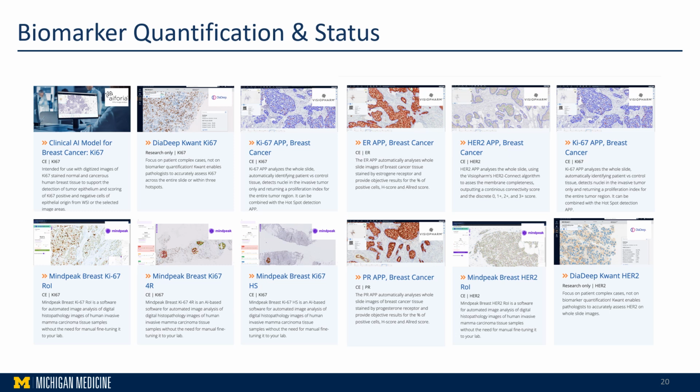These technologies quantify pathology immunochemical stains, and automatically quantify the positive and negative staining cells, nuclear staining, or the membrane staining, and this will hopefully show an increase in standardization and uphold the accuracy of such quantifications as these biomarkers are used for treatment decision making.